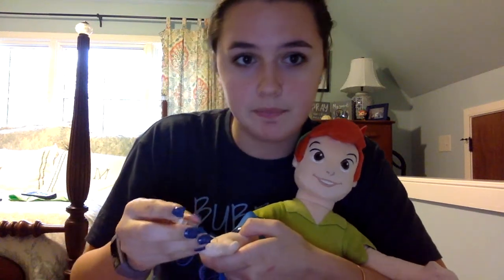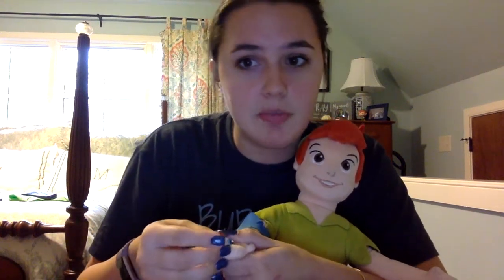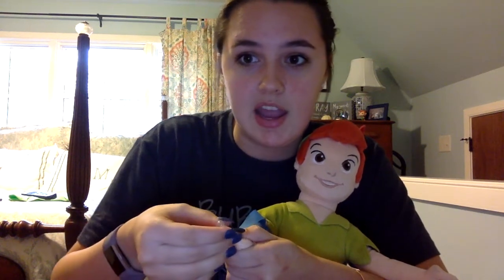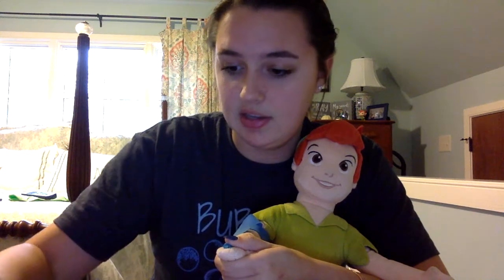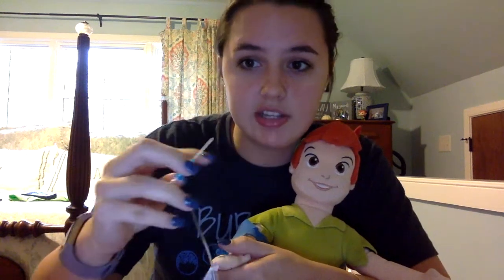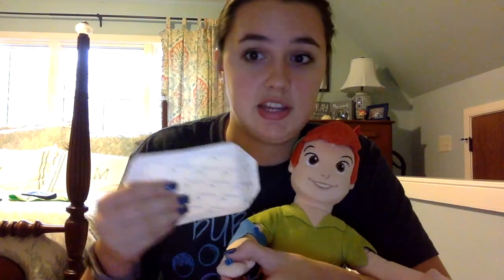And then the nurse will take the poke, this is the poke, and they're going to say 1, 2, 3, poke. And they're going to put the poke in, but guess what? The poke comes out after. And all that stays in is this little bendy straw. And so the straw stays in, and the nurse will put a piece of tape or a Band-Aid on your hand to make sure that the straw stays in and they can give you all of your fluids.